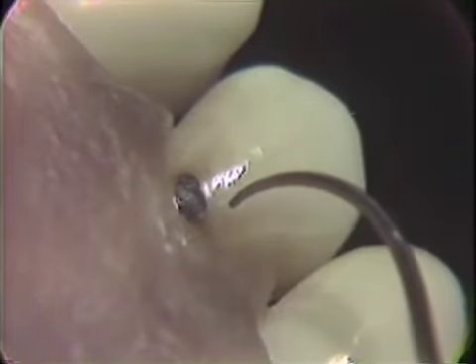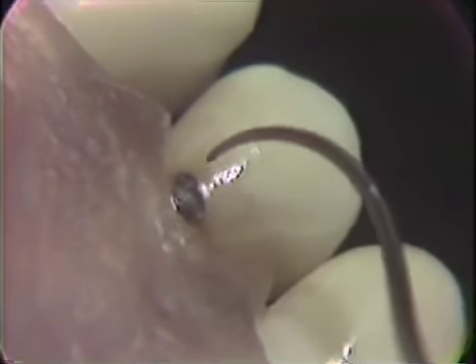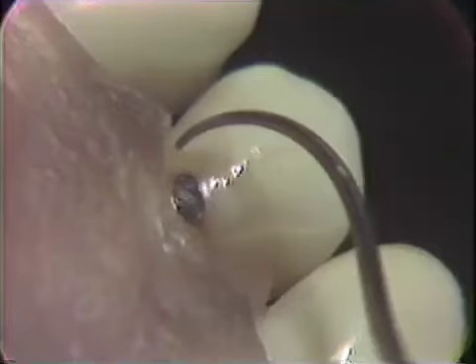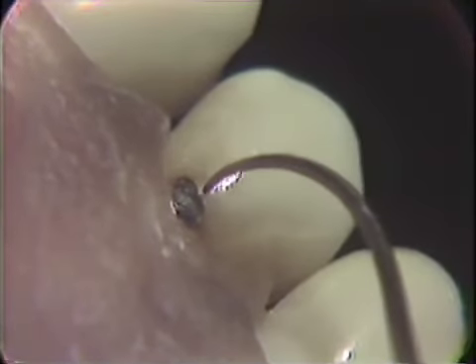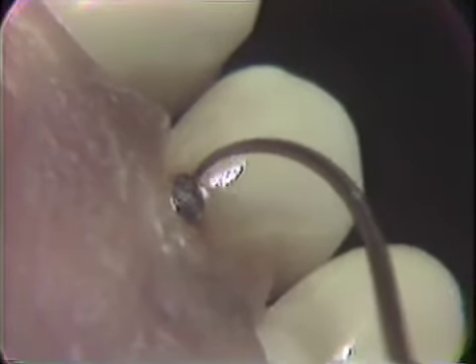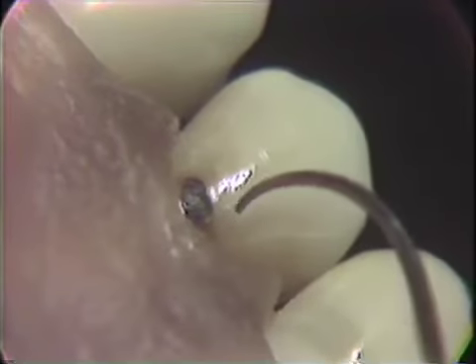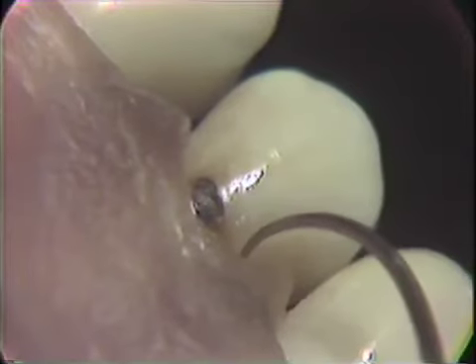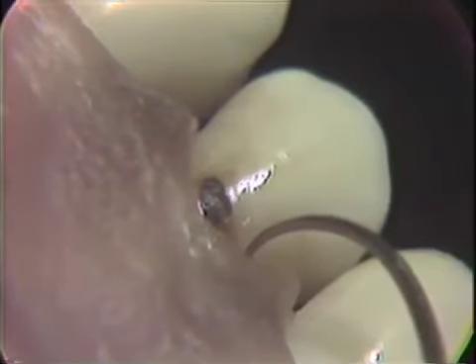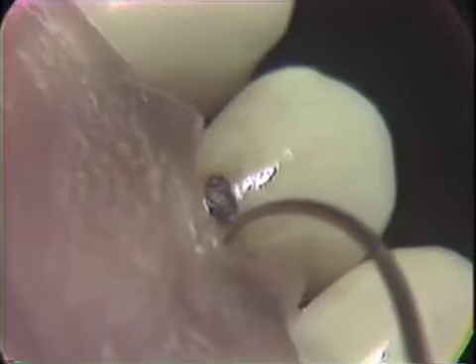In planning the preparation, we will be doing a farrier design. The farrier design is really trapezoidal in shape. The occlusal margin would include just the occlusal aspect of the carious lesion. That margin would parallel the plane of occlusion, carry on over to an area that is just subgingival on the distal, an angle formed subgingivally.